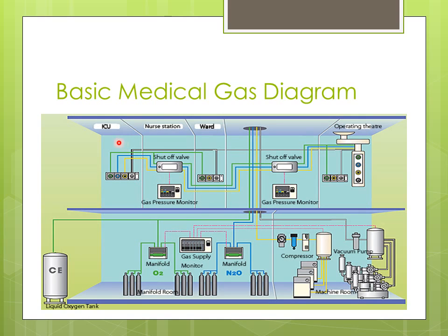And you'll see the same thing over here in your ICU. Here's your outlets to your bed. Here is your shutoff valve outside the room. There's your gray line. And here's your gas pressure monitor. So a nice basic design.